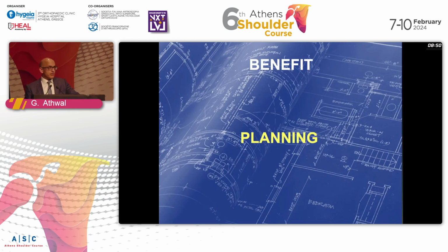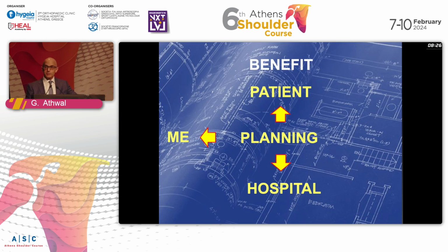So what is the benefit of preoperative planning? Certainly, preoperative planning helps me. It helps me be more efficient. It helps me anticipate the challenges during the operation. It allows me to think of the implants I'm going to be using. It certainly speeds up the operation. It also is actually beneficial to my patient. I'm going to hopefully decrease the risk of early complications and provide them some value. It's actually helpful to my hospital too, because the nurses that I work with know what implants they're going to be using. They have those all ready. They have the instruments ready. And hopefully through this presentation, I'll demonstrate how it's going to be valuable to you also.